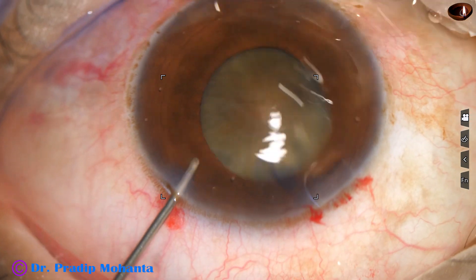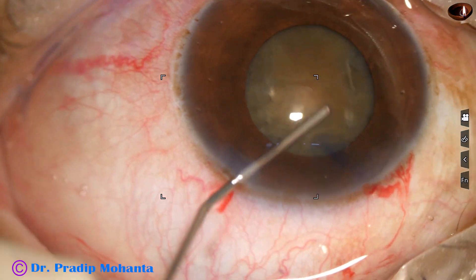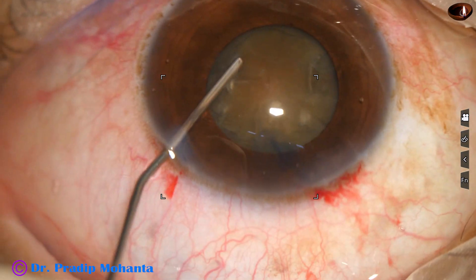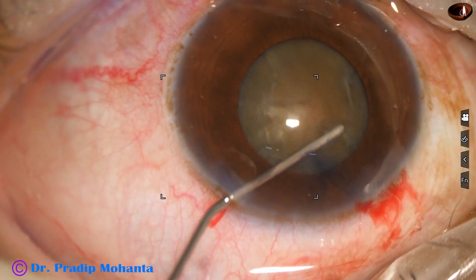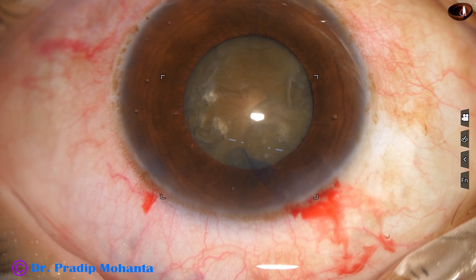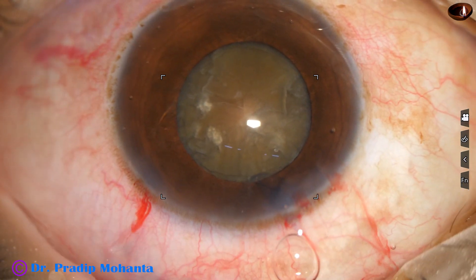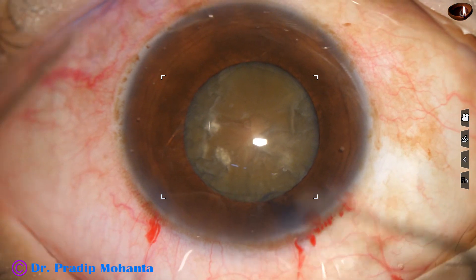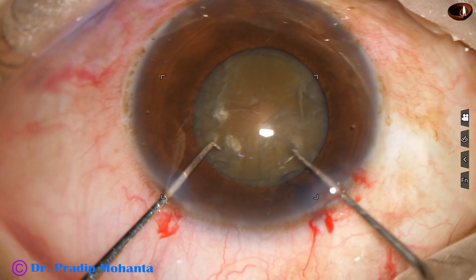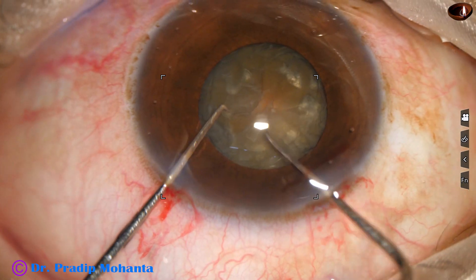The problem is, as I start to chop this nucleus, the size of the pupil will come down. Now, gentle hydrodissection is done. Visco is injected. I take two hooks and bimanually rotate the nucleus. It is rotating nicely.